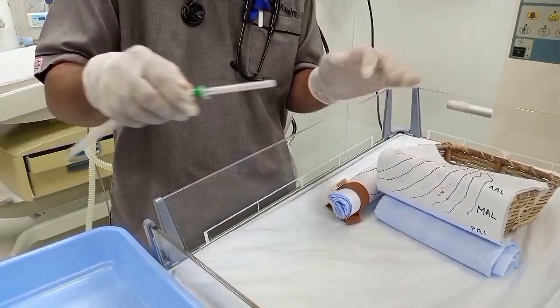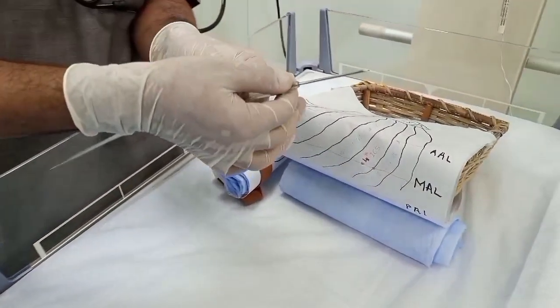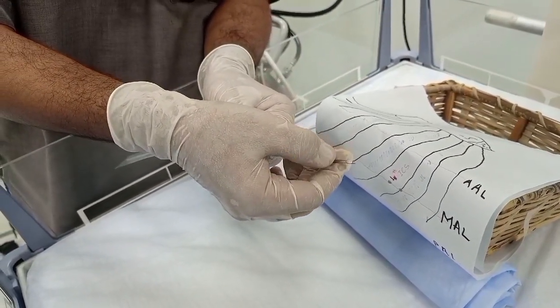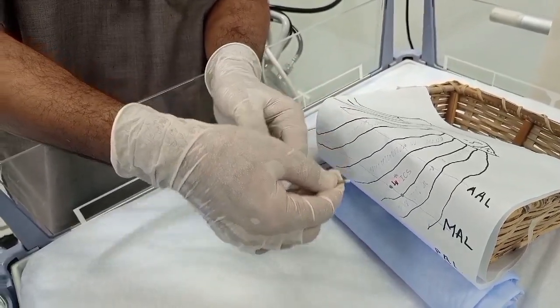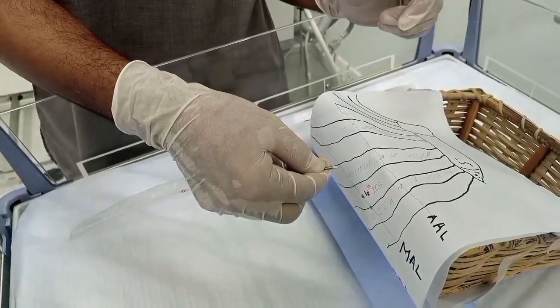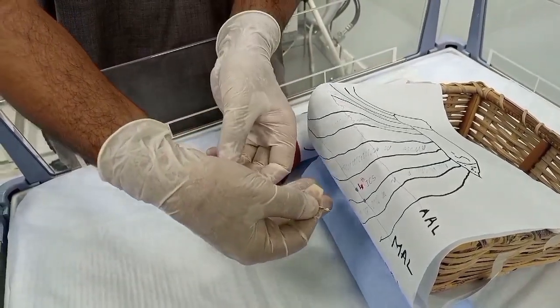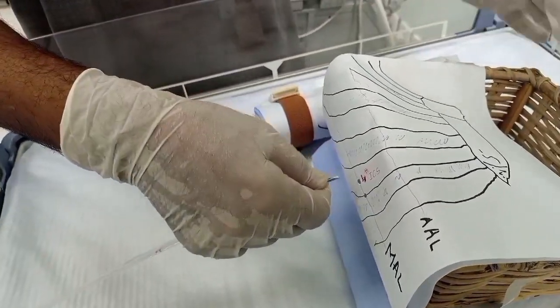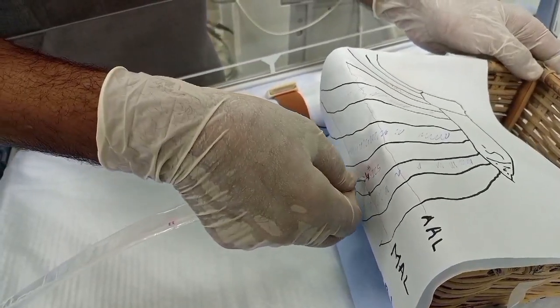Take the needle holder and remove the cap. The important part is that you grab the needle with your index finger and thumb, one centimeter before the tip, to prevent excessive entry of the needle and damage to internal organs. Holding it firmly, the rest of the needle rests inside your palm. With your assistant supporting the patient, go in at 90 degrees.